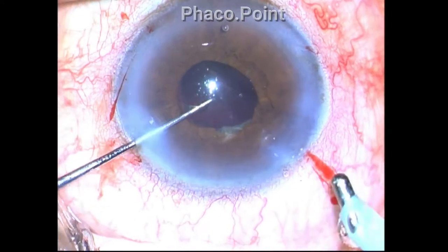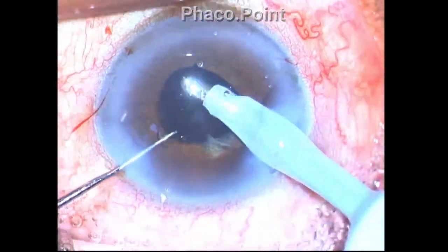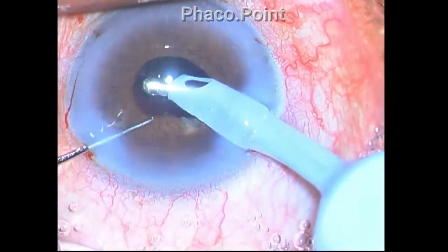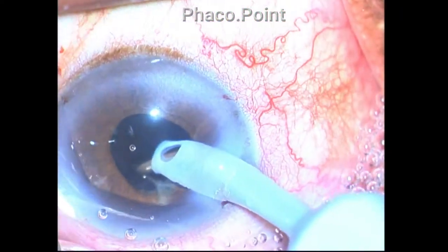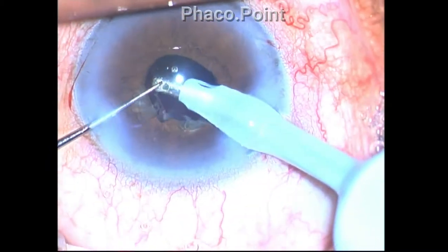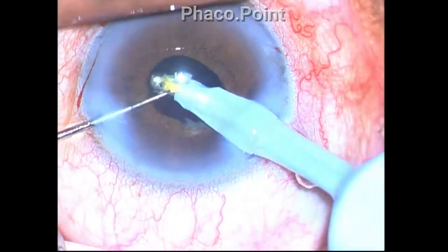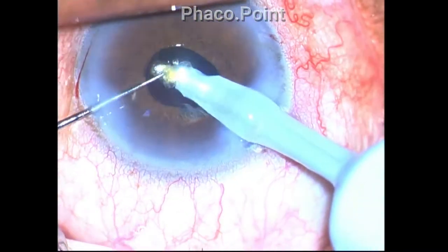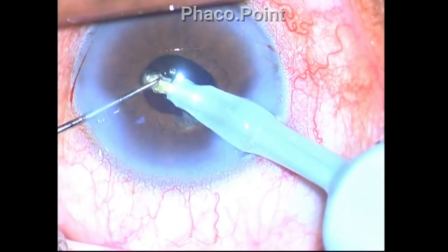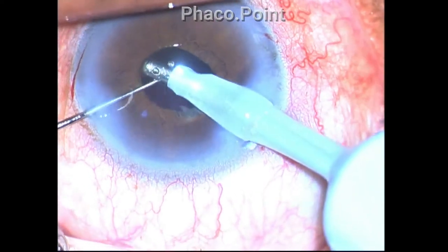I attempt to remove the cortex using a Sinski hook to retract the iris, but find this device is quite inadequate. Even though you're able to retract the iris by pulling on the surface, the chafed portion tends to come within the coaxial IA port. A small nucleus fragment that was left behind is crushed and removed through the coaxial IA port.